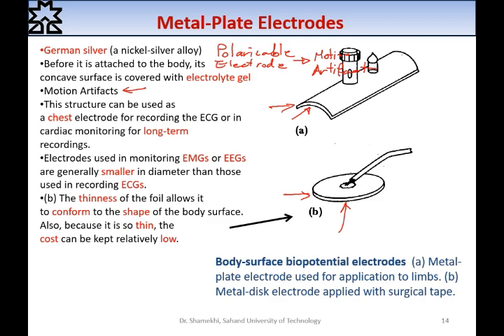But non-polarizable electrode has less motion artifact problem. This structure can be used as a chest electrode for recording the ECG, or in cardiac monitoring for long-term recording.